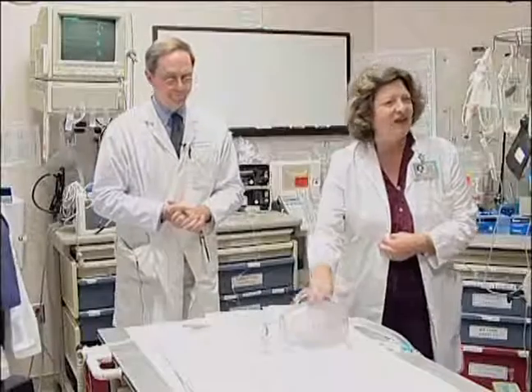Sometimes people get excited and of course they're bagging at a very high rate. And think about the size of your hands. Dr. Hoyt actually has us sometimes bring a meter with Laerdal to the trauma conference and makes the residents do it one-handed so they can see what their hand can generate. And everybody should know that when you think about it.